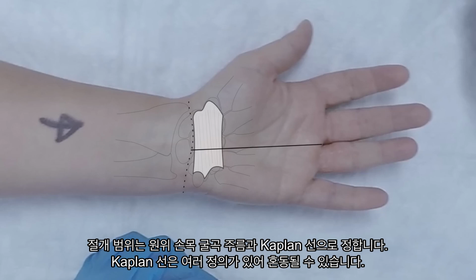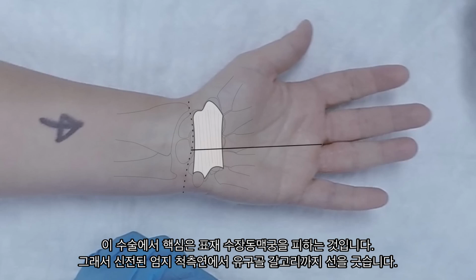There have been many described variations of Kaplan's line, including by Kaplan himself, to identify the location of different structures in the hand, such as the superficial palmar arch or the motor branch of the median nerve, and that can be quite confusing. In this procedure, we're most concerned about the superficial palmar arch.